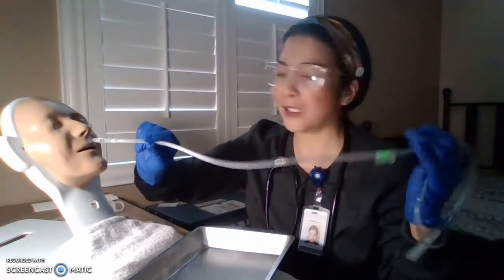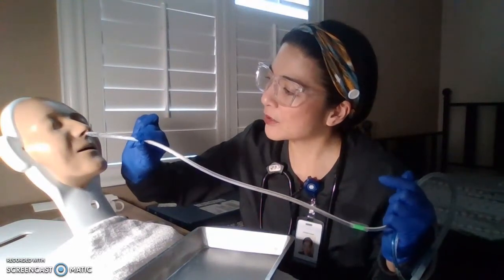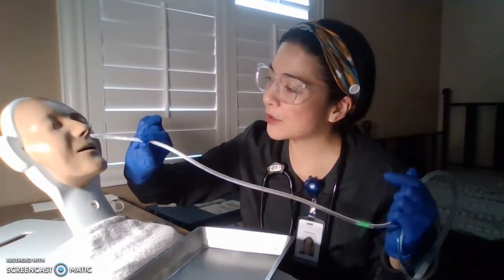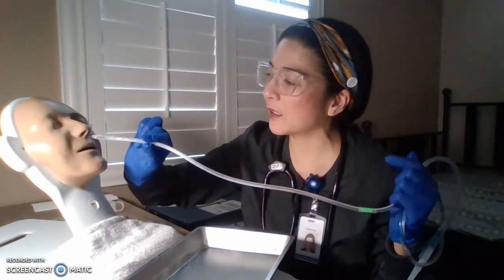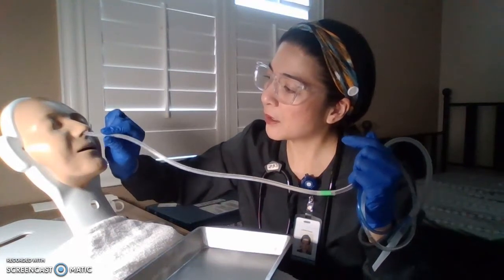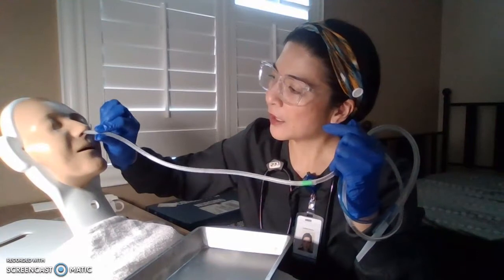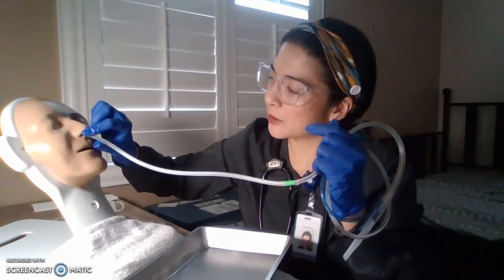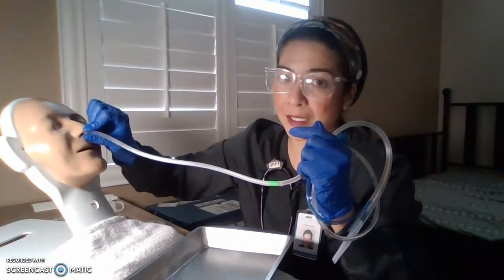All right, so now let's start the procedure. Mr. Sunny, I'm now going to insert this tube in your right nostril. If there's anything that you need to tell me or want me to stop, just raise your hand, okay? Thank you. You may feel a little bit uncomfortable at this moment. Okay, I'm just going down slowly, straight and down.